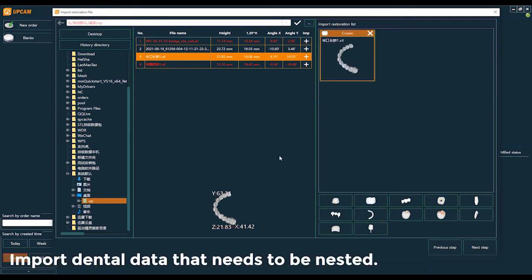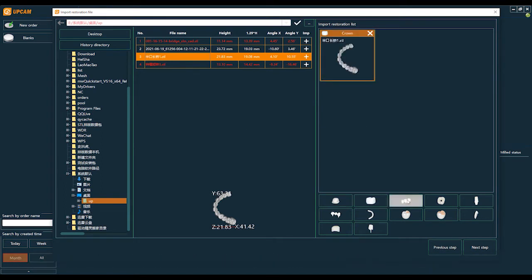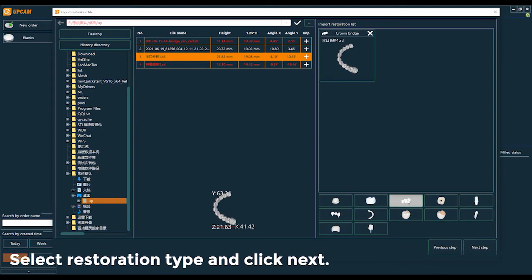Import data that needs to be nested. Select restoration type and click Next.